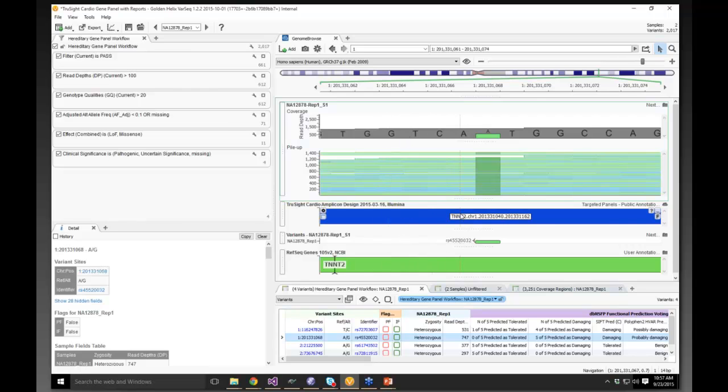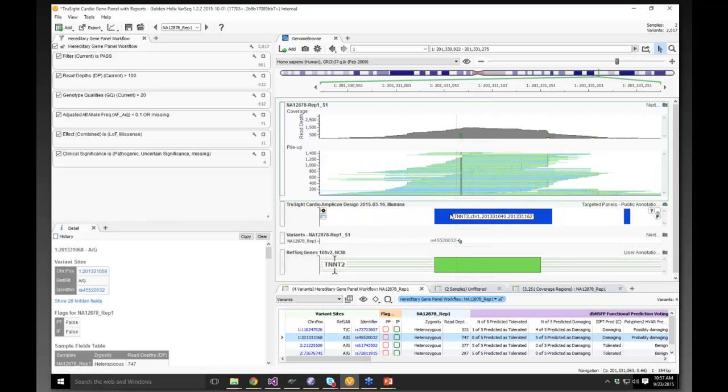They take this BAM file and this region file and essentially give you the statistics over this region of your average, minimum, and maximum read depths, and help you define regions essentially that are potential false negatives where you would not be able to detect a potentially significant variant from a clinical perspective, and then help you decide, oh, I might have to fail the sample because of that.